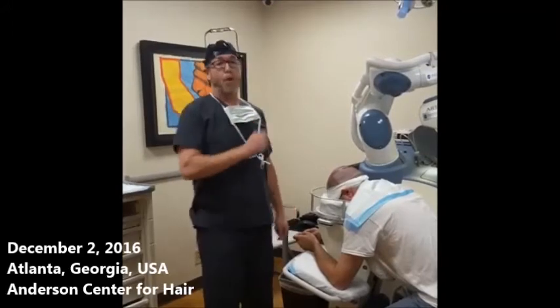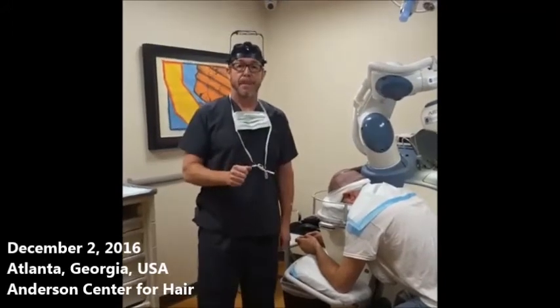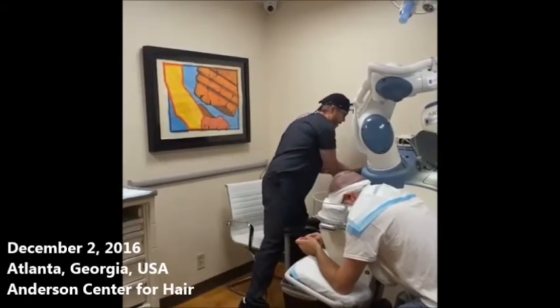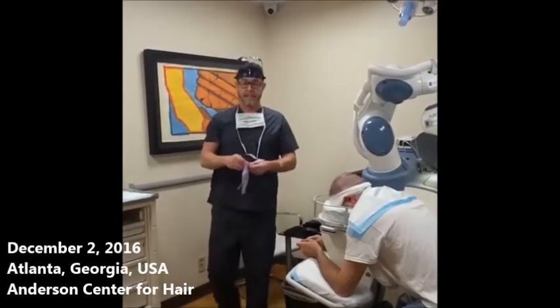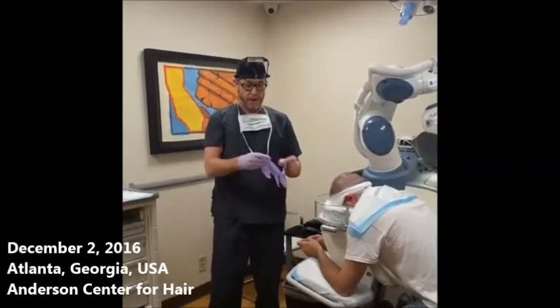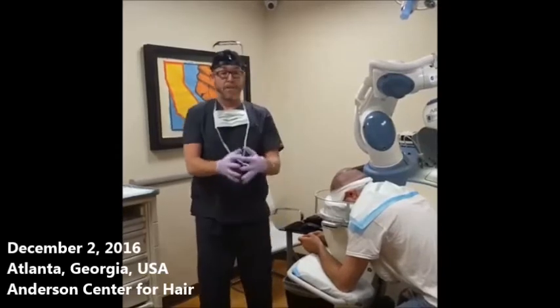To do that, I'm going to have the robot measure the hair length for us. We'll use vinyl gloves in case anyone has a latex allergy — prevention is the best form of preventing any sort of problems there.